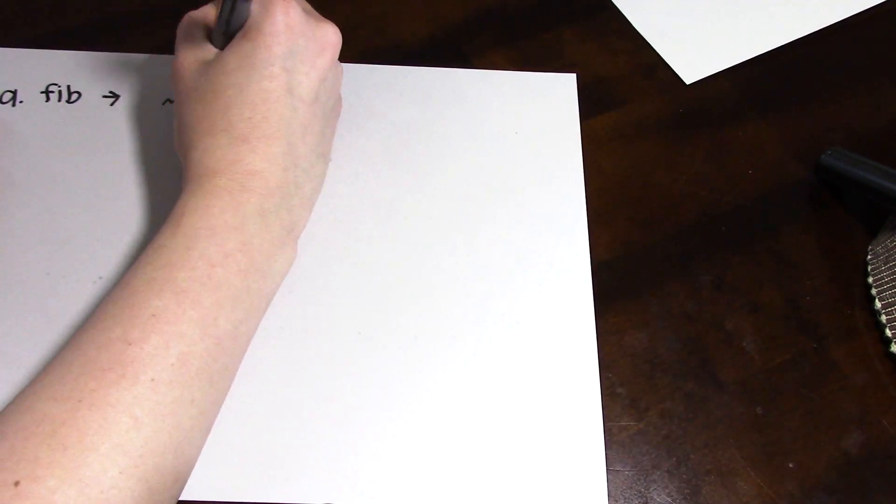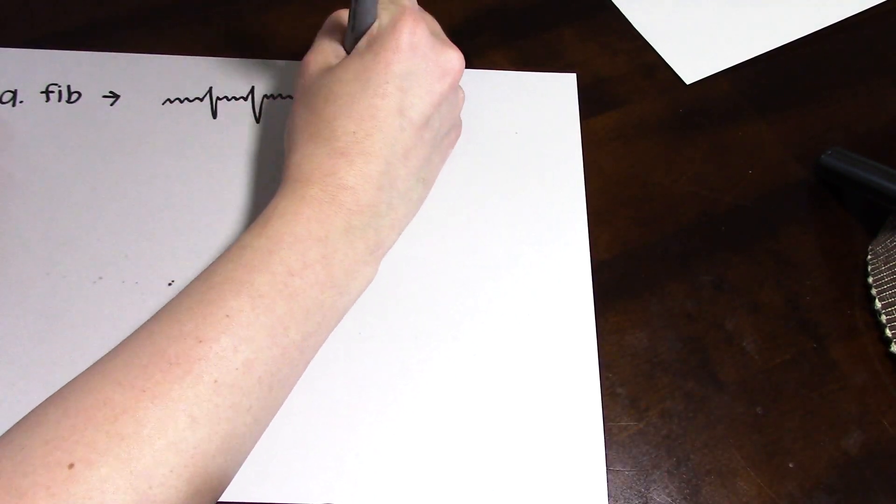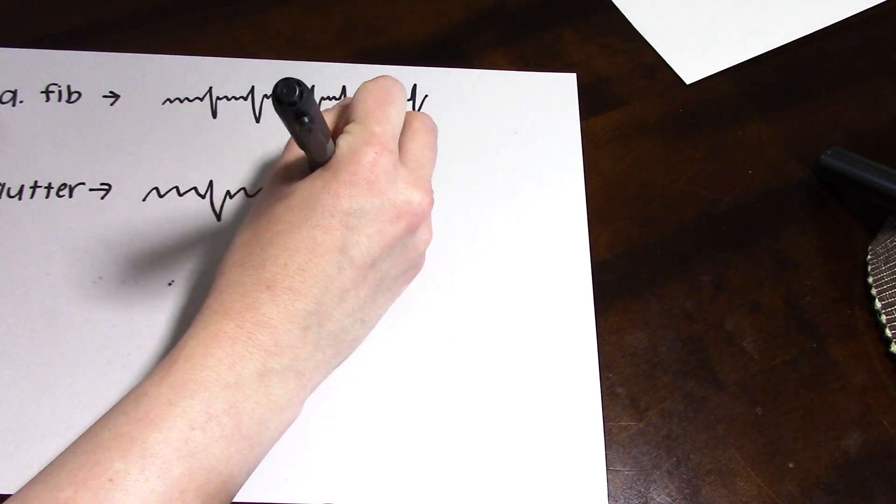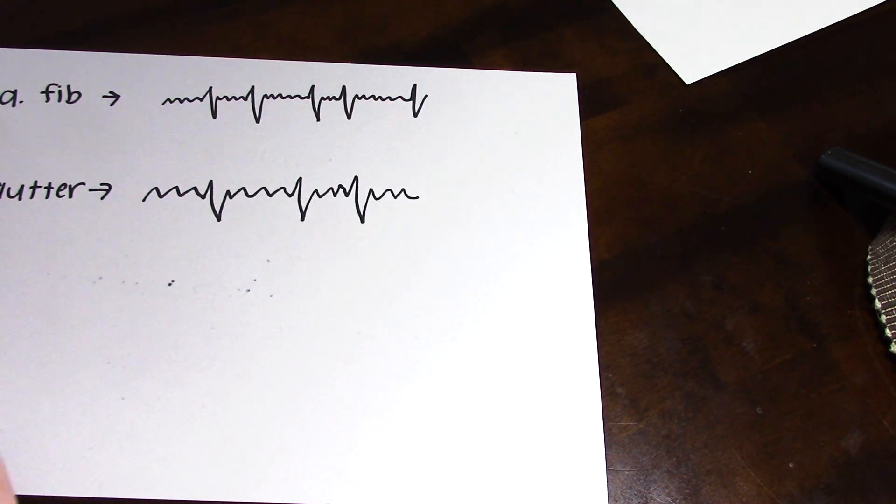So just a little comparison for you guys. In atrial fibrillation or afib, you have the fibrillatory P waves that look like a little squiggle line. And in aflutter, there are sawtooth P waves that look a little bit more sharp.